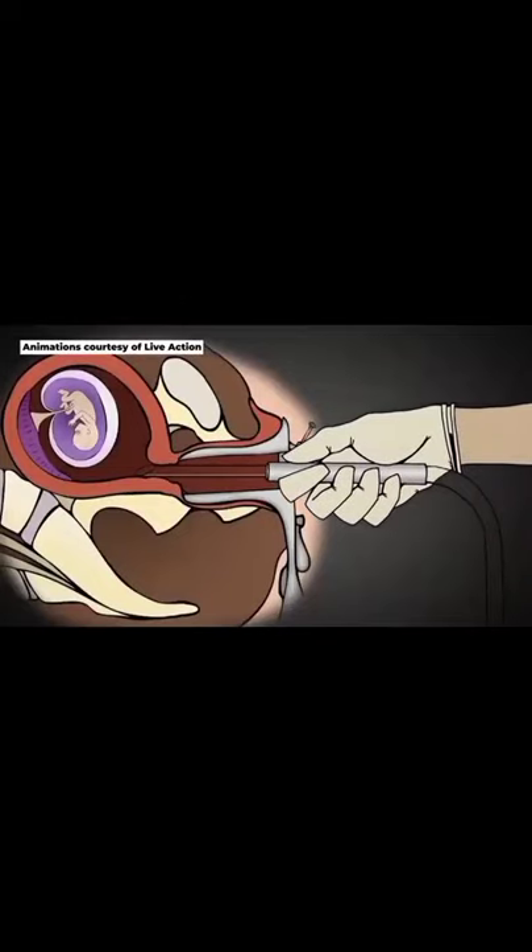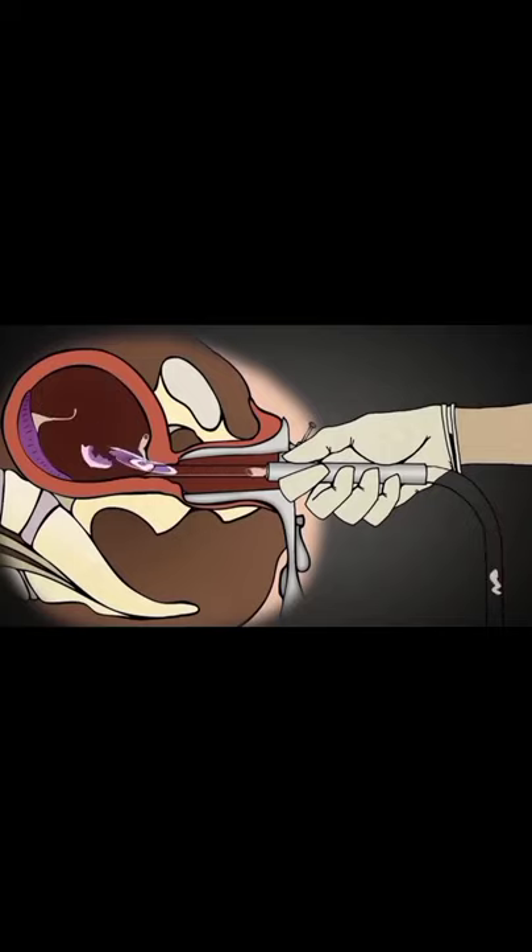The suction machine has a force 10 to 20 times more powerful than the usual household vacuum cleaner. And using this technique, the baby is rapidly torn apart by the force of the suction and squeezed through the tubing.